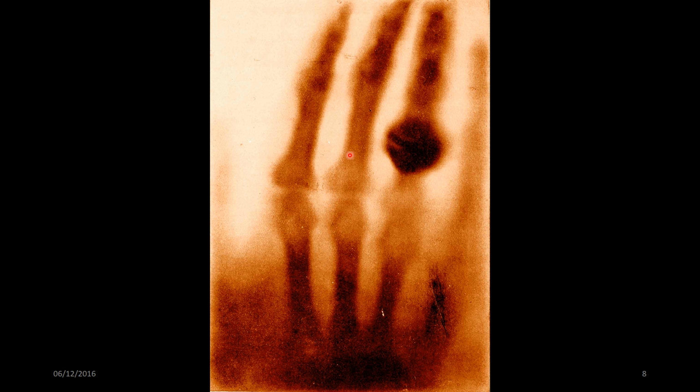So if you're wondering what this is here, it's her wedding ring. We believe it's her wedding ring. And obviously it looks a little bit like a potato, but you can recognize that you've got metacarpals here, and then you've got your phalanges and a wedding ring, creating artifacts. It took about half an hour to take the first ever X-ray, coincidentally.